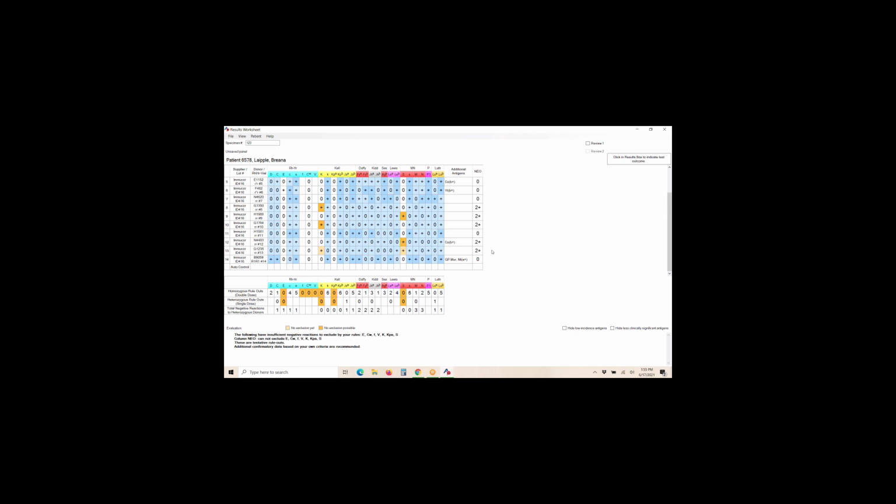Okay, so what are we going to do next to try to clean this up? Well, we know we can go after the big E. So that's going to be where we're going to go next, but we're just going to save this panel and we're going to do another panel off of the machine. A lot of times you get your results, you're really not sure yet. While you're doing all this thinking, we just set up another panel. Some labs don't want to do that. They want to go right to selected cell panel, but for the demo, that's what we're going to do for these few cases we're running.